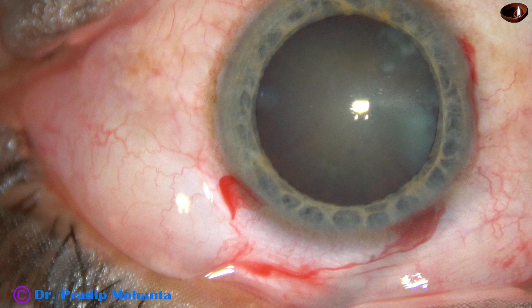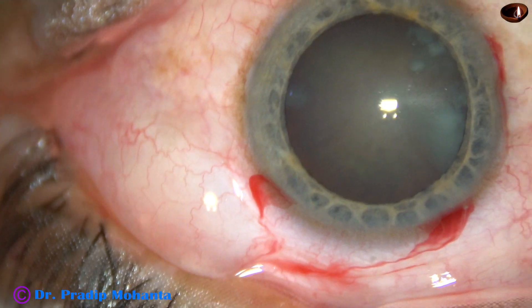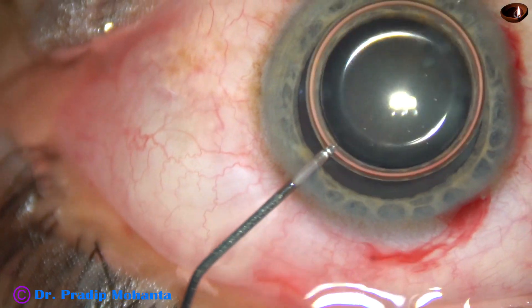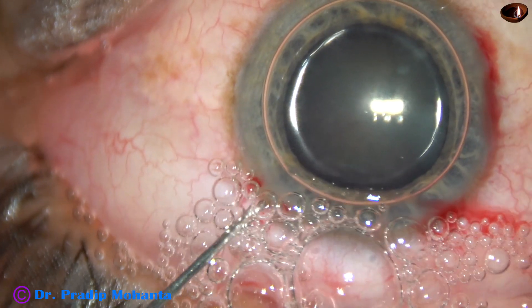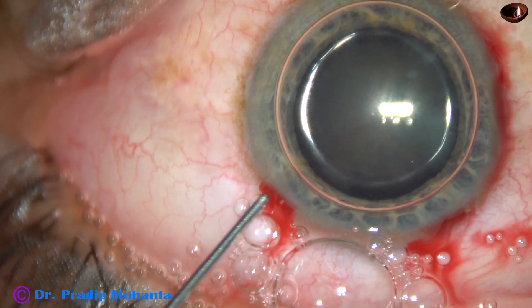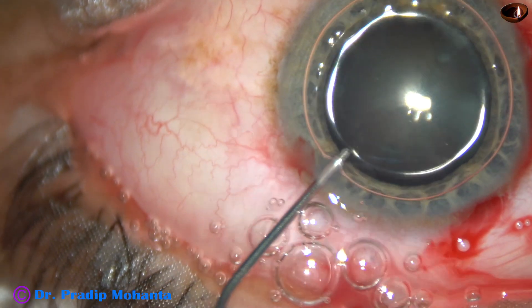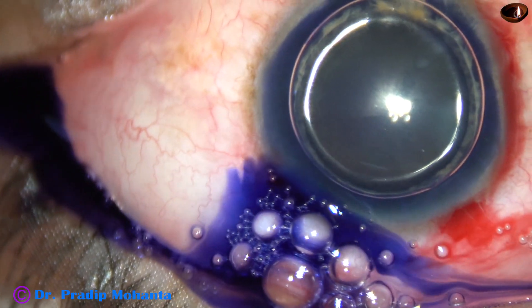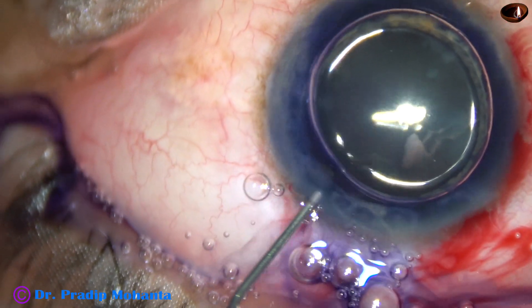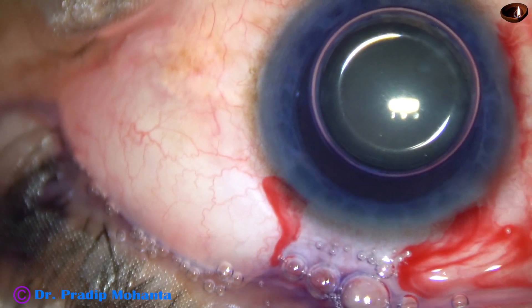By this time, all the incisions have been made. And now, the anterior capsule of this cataract will be stained with trypan blue dye underneath this air bubble. When we apply the dye underneath an air bubble, the staining is very quick. If we apply the dye in aqueous, we have to wait for about 20 to 30 seconds. But here, the staining is immediate.